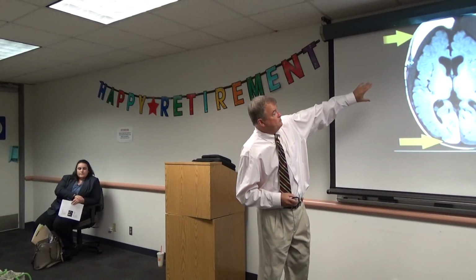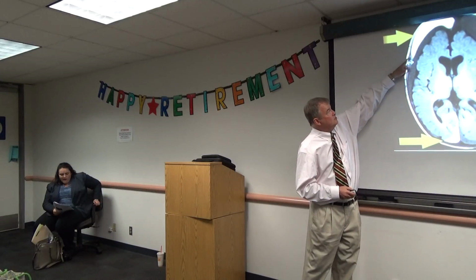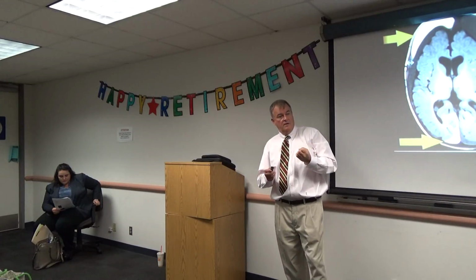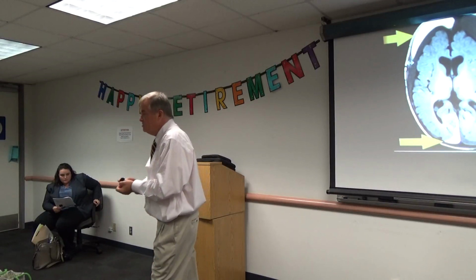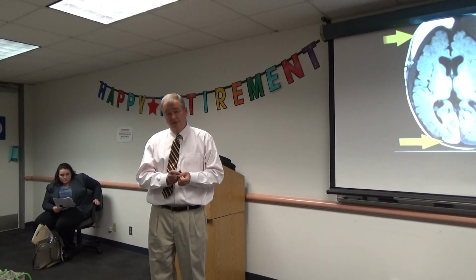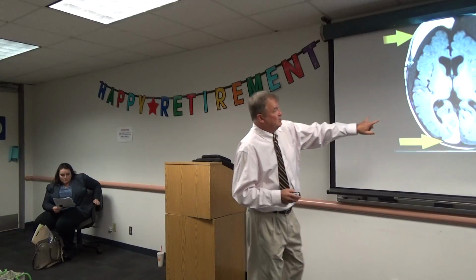Because this, by the way, is an MRI, and you see the white, because of the water densities, but that's blood. And in this particular one, you see a water density of blood, and you see a darker layer underneath. These are two different bleeds. The white bleed is the acute bleed, the dark bleed is the older bleed. This, again, is devastating information. You have different layers of bleeding around the brain. That's usually a very, very poor prognosis, and typically is associated tremendously with abuse. And you can see in this particular case, these are old bleeds because the brain has been shrunken down within the skull. So this is one of those devastating problems.